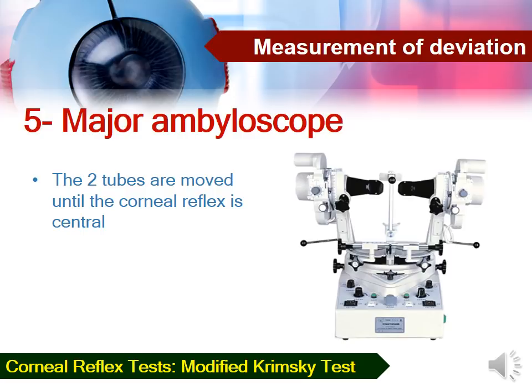The major amblyoscope or synoptophore can also be used to measure the angle of deviation. In fact, the synoptophore can measure the angle of deviation in many different ways. One of them is the corneal reflex. We will discuss the synoptophore later in a separate presentation, but for now, let us note that the synoptophore has two illuminated tubes. You can see the reflected light reflex of the illuminated tubes on the corneas of the patient. The tubes can be angulated until the light reflex is in the center of the pupil of both eyes. The angle can be read directly from the synoptophore.